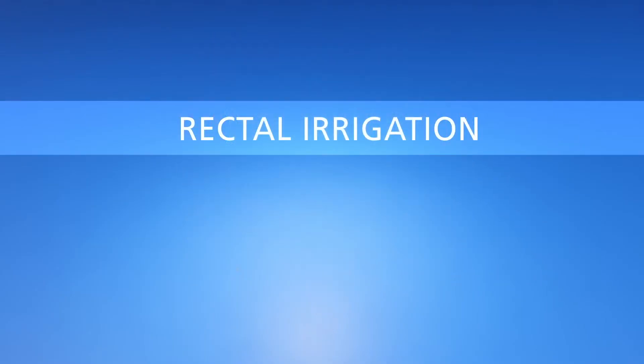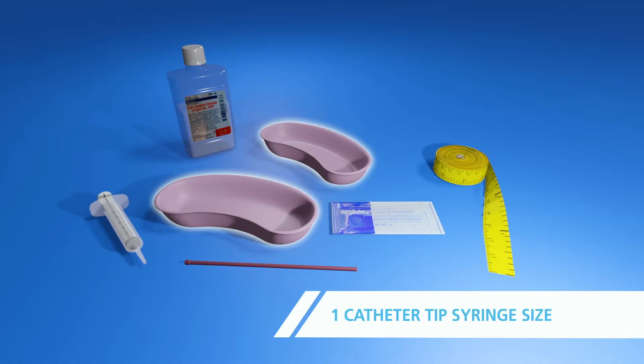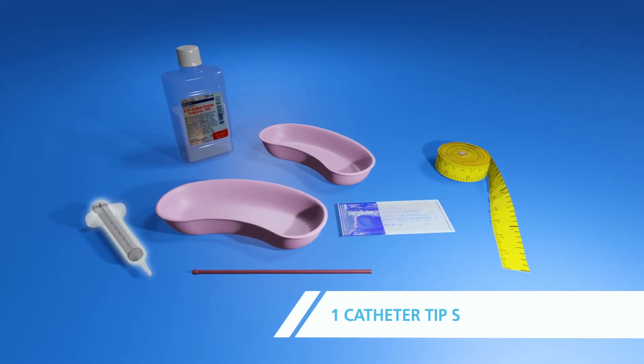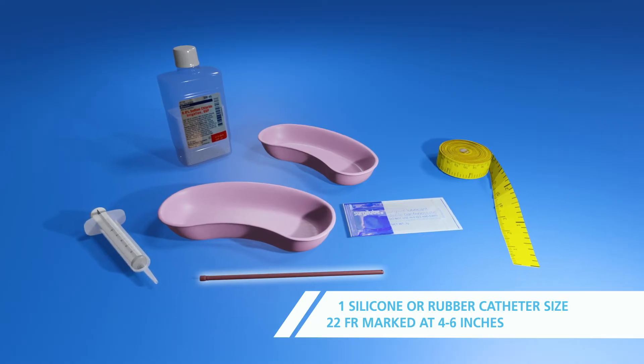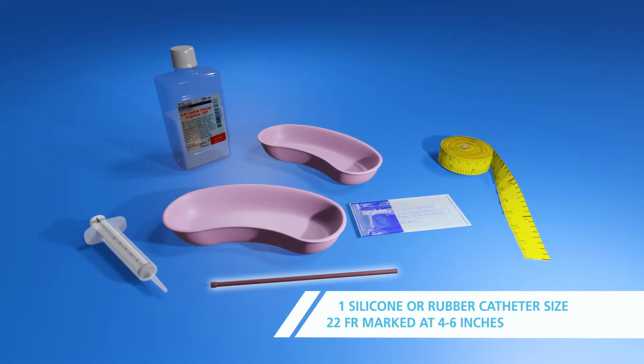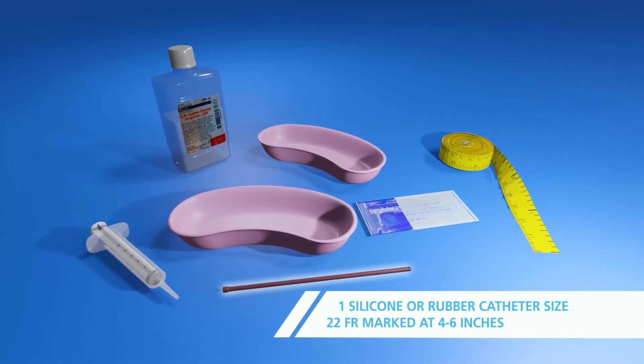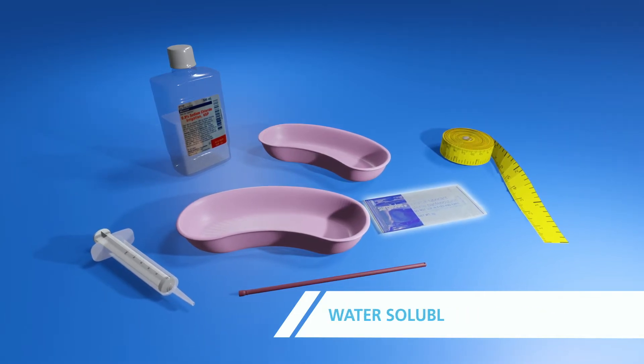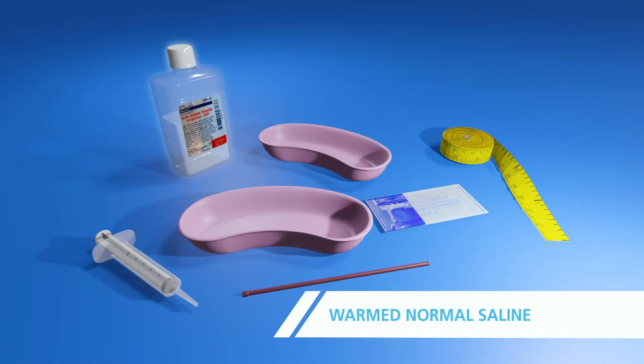To perform a rectal irrigation, you will need the following supplies: two small basins, one 60 milliliter catheter tip syringe, one 22 French silicone or red rubber catheter marked at 4 to 6 inches, water-soluble lubricant, warmed normal saline, and a tape measure.